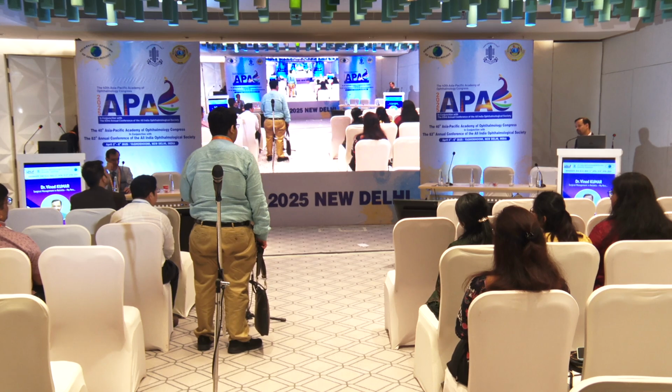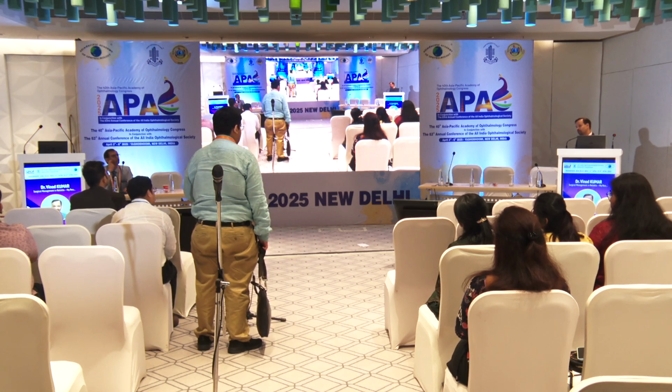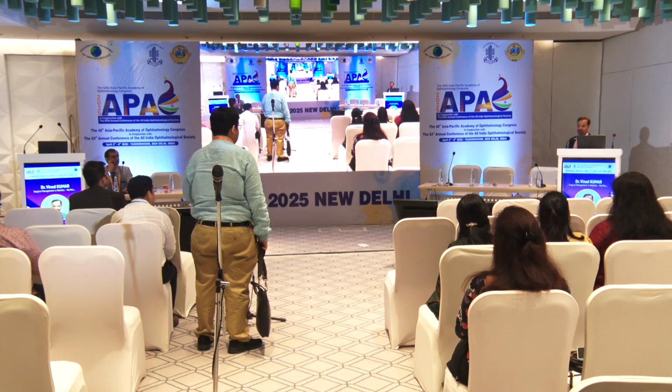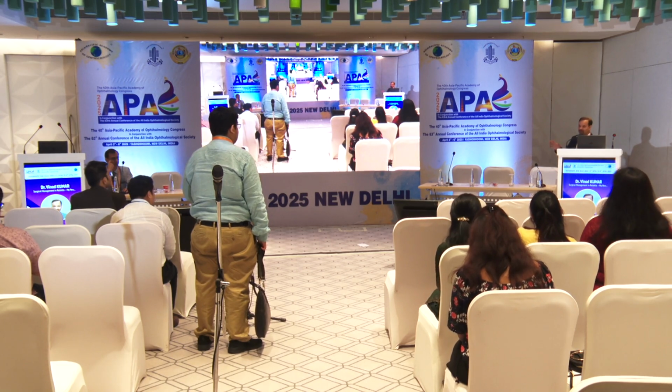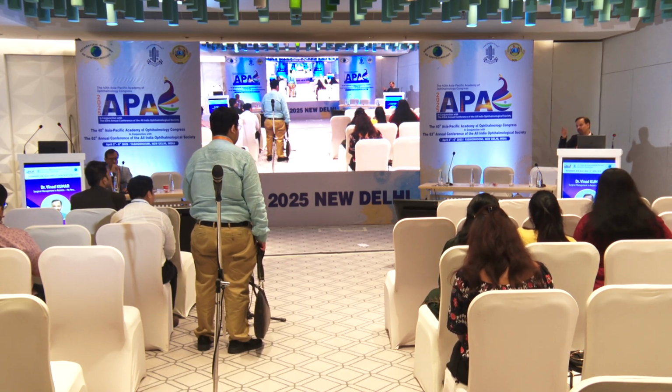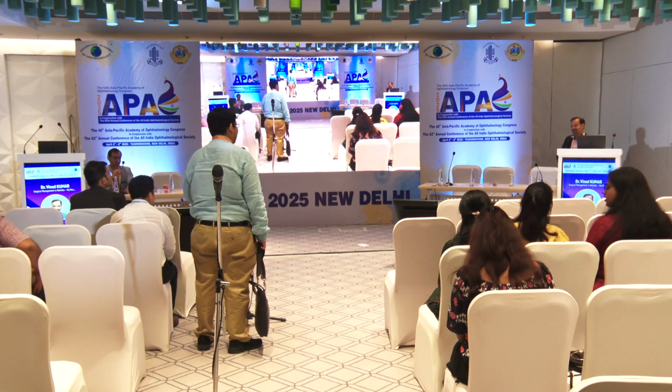So how do we prevent break formation in the healthy retina? Sometimes the vitreous gets attached to that retina, and then if we laser that area, there are chances of break formation due to that vitreous contraction over the retina, sir. One has to ensure that we remove all the vitreous. So if there are multiple sheets, you need to go till the last one, and what you can do is when you reach the so-called periphery, you can give circumferential relaxations in the vitreous, not in the retina, so that it does not contract. Yes, sir. Circumferential.